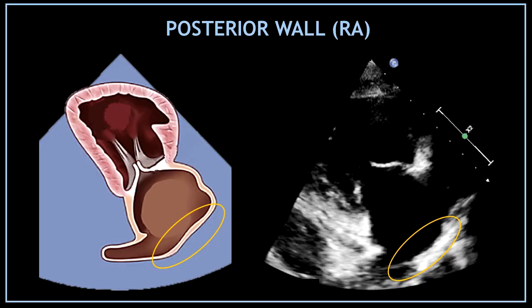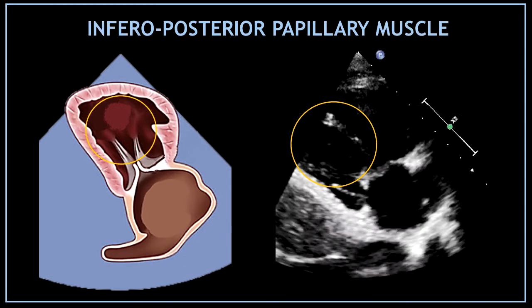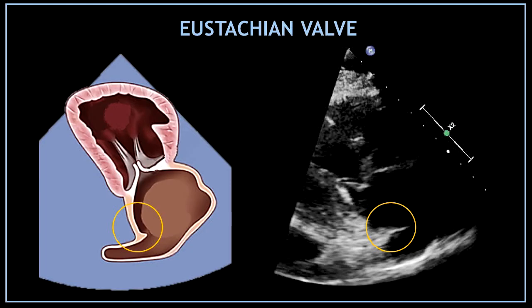That very bright posterior line is the posterior wall of the right atrium. The papillary muscle visualized in this view and attached to the tricuspid valve is the inferior posterior papillary muscle. In this view, sometimes you can see a thin blurry line at the top of the screen on top of the inferior vena cava — this line is the eustachian valve.